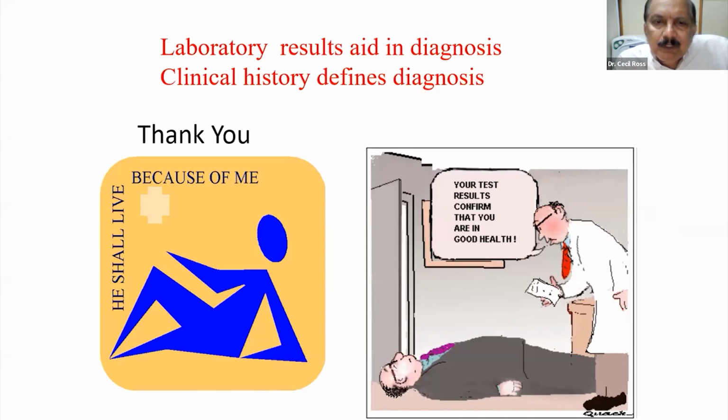How many seconds of prolonged APTT needs evaluation in asymptomatic patients? Normally in our laboratory, if it is more than 6 to 7 seconds, we take it seriously. Then you have to ask the laboratory whether the APTT testing they do uses a lupus sensitive APTT reagent or a normal APTT reagent. If they use a lupus sensitive APTT, it could be normal. But if they are using the normal, non-lupus sensitive APTT, then it means a factor deficiency, which you have to really look for.